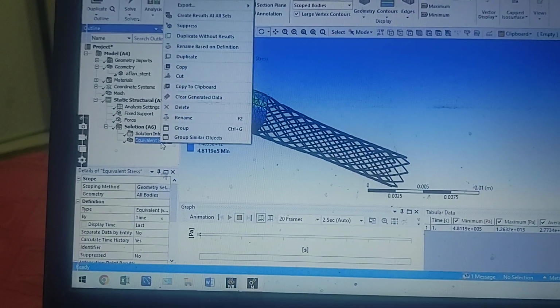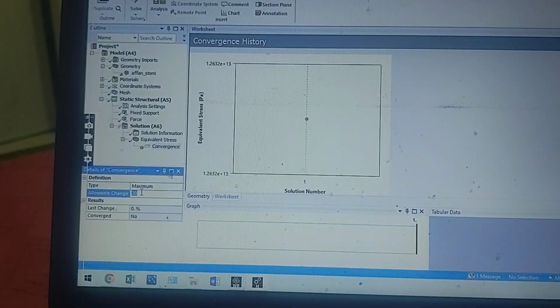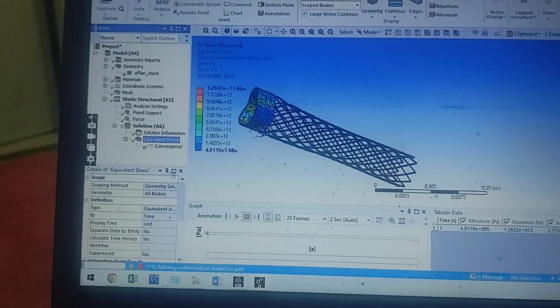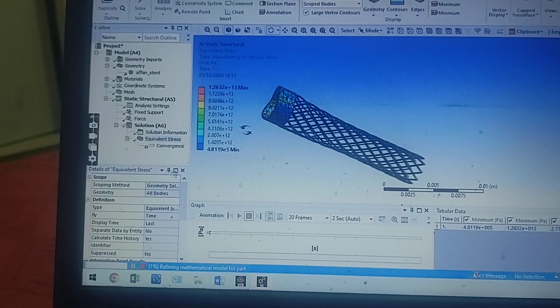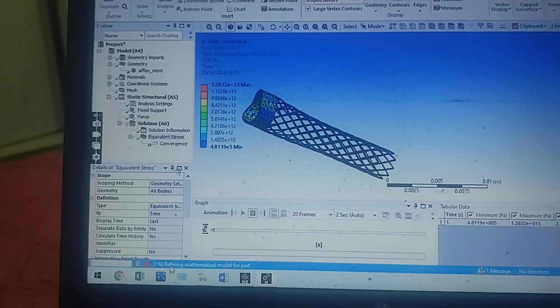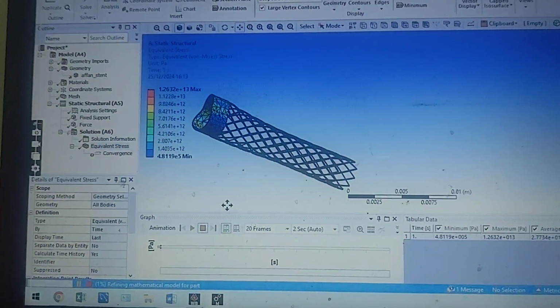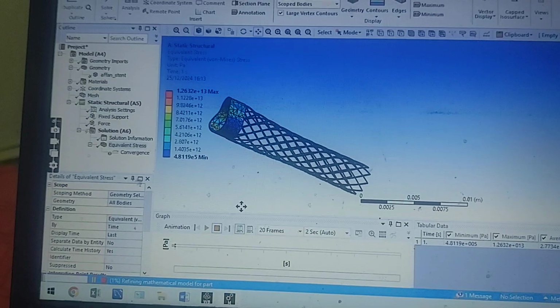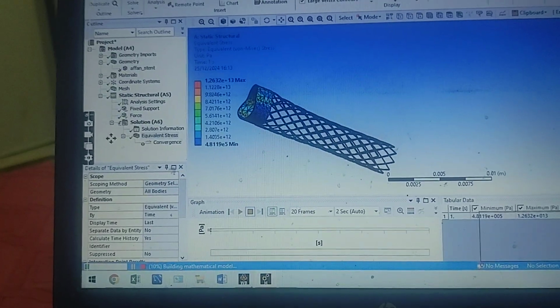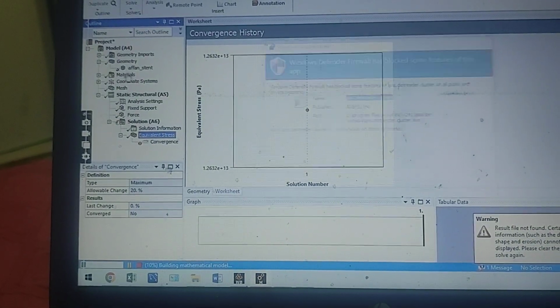One more thing about the stress, you can use a convergence test here. Give a convergence value of 20, or it's up to you. You can give any other value. Okay, this will take some time. 1% refining the mathematical model. Convergence means the model will be independent of, you can say, the mesh. If you change the mesh, the stresses will not change. So you can change refinement loops, or many settings are here: mesh setting, material.